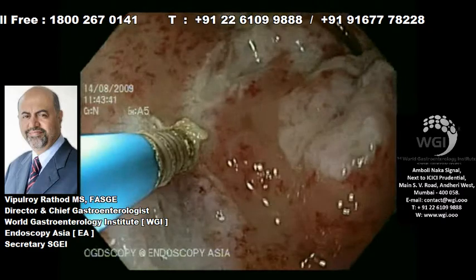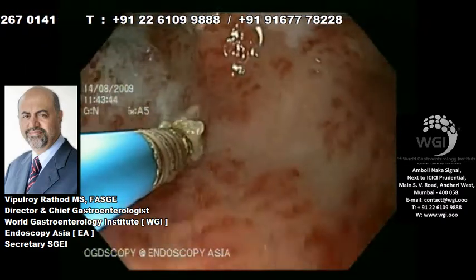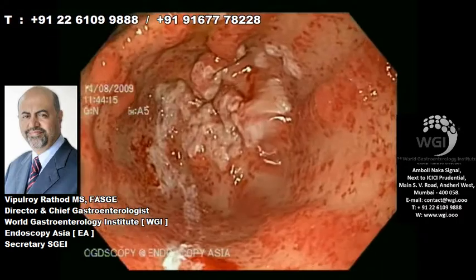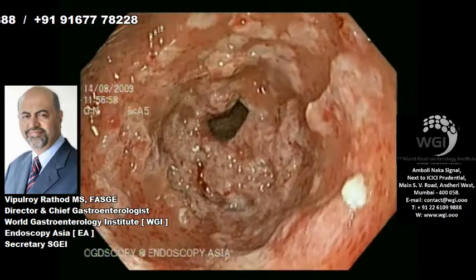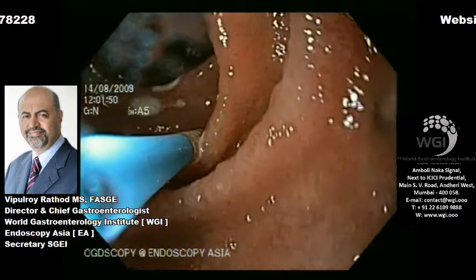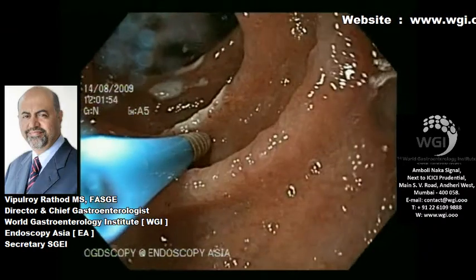Over here, it is extensive heater probe coagulation, which should hopefully sort his problems out in the imminent future. You may need more sessions, and we tend to repeat heater probe therapy or argon plasma coagulation at eight-weekly intervals until the anemia resolves and the endoscopic picture improves to a significant extent.